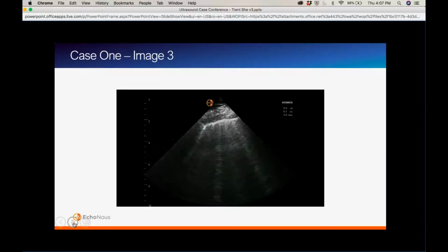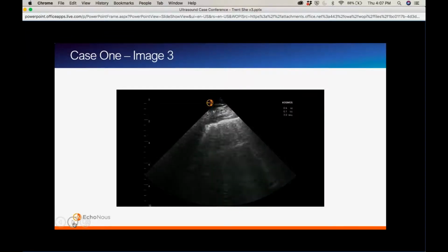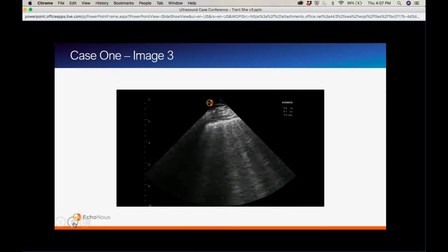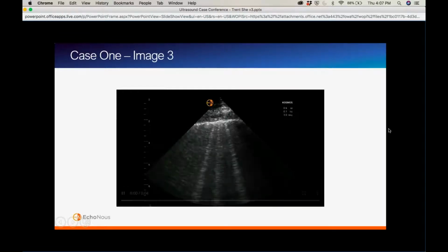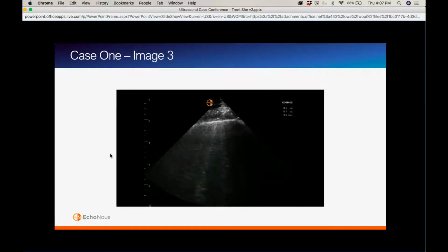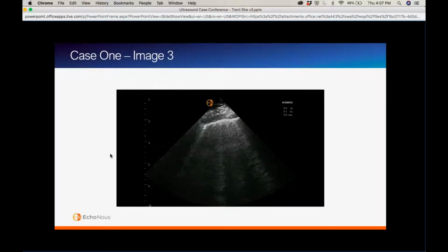And what you see here is that the pleura is moving. That's that big, shiny, hyperechoic area up top. And you can see those really bright searchlight-looking things coming down from the pleural line. Those are B lines, generally representing some form of edema in the lung itself. This finding was pretty odd to us because usually pulmonary embolisms don't cause diffuse B lines and diffuse pulmonary edema. It was honestly an odd finding to see.